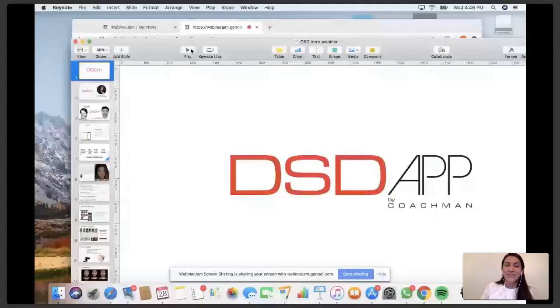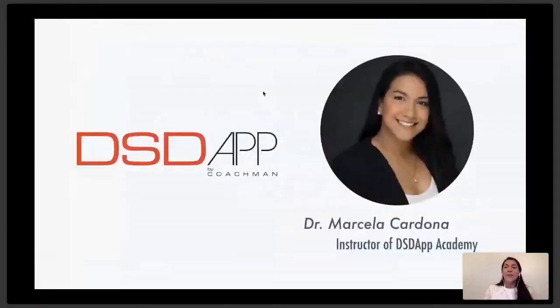Let me get my screen shared. Okay, great. Now I'm going to start my presentation. Excellent. So I want to welcome all of you to our introductory webinar for the DSDApp.